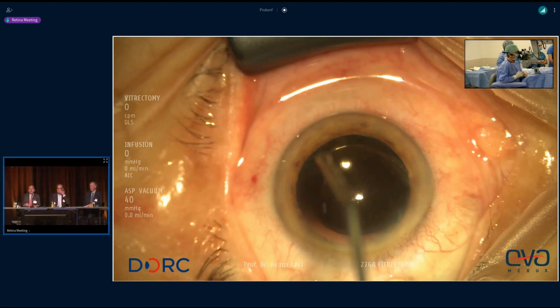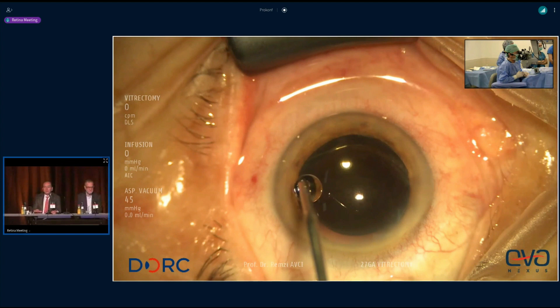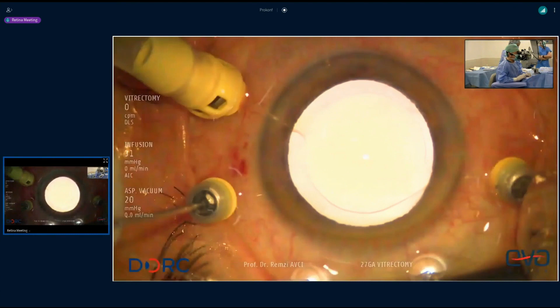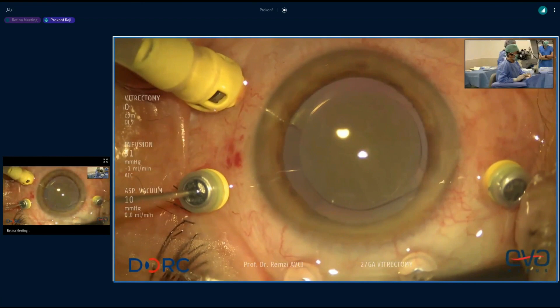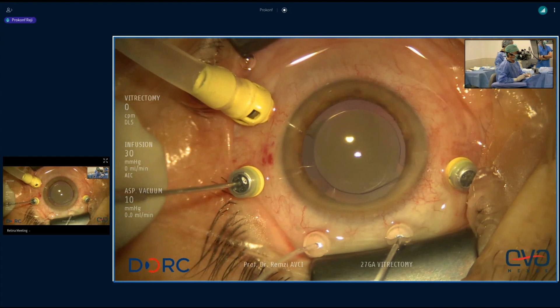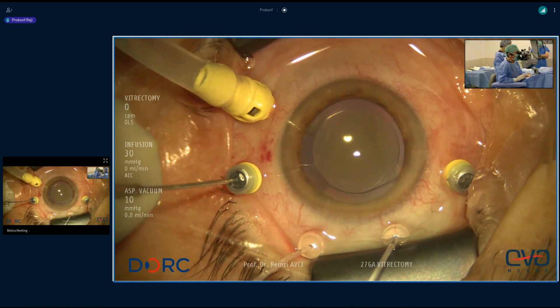We're delighted to begin with a very innovative and exciting group of live surgery in Turkey. Dr. Avci, we're with you. We saw a view of the macular hole briefly. Good morning again, dear colleague. I will operate a case with a very large macular hole. This is my regular setup for macular surgery. I use 27 gauge trocar, and chandelier is not regular, but for this live surgery case I prefer to add chandelier light also to get better illumination.